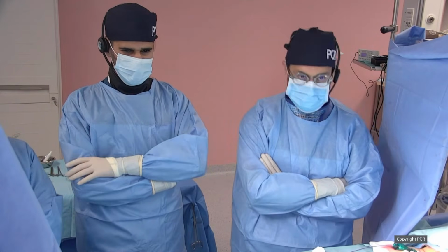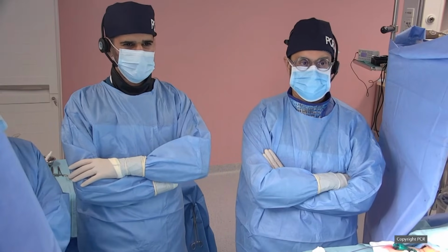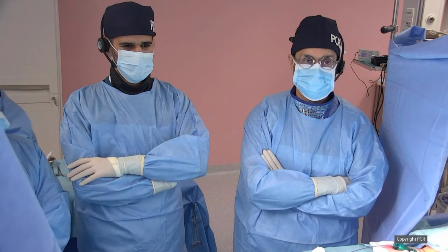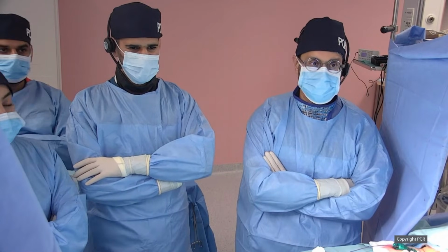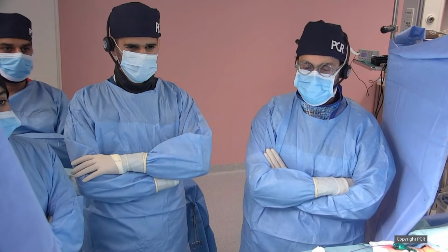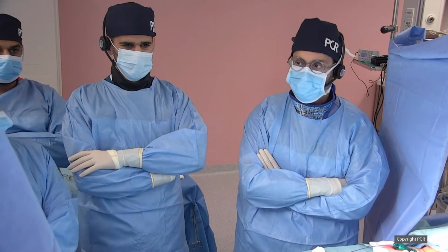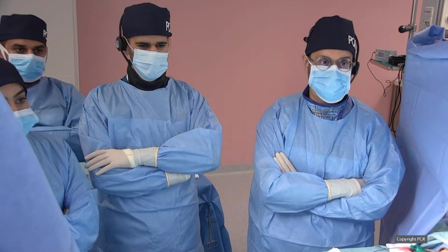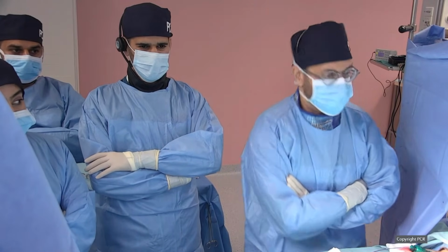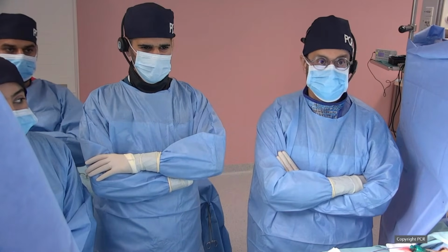Good afternoon, everybody, and welcome to this live transmission from the National Heart Center at the Royal Hospital in Muscat. I'm Hatem Lawati, and joining me is my colleague, Dr. Adil Al-Jabri, and assisting us with this case from the nursing team are Maryam Al-Ma'mari, Zakaria Al-Ma'wali, and Ahlam Al-Balushi, and from the technical team, Yusuf Al-Farsi, Salim Al-Muqbali, and Shihab. And our anesthesiologist today is Dr. Haifa Zabi.